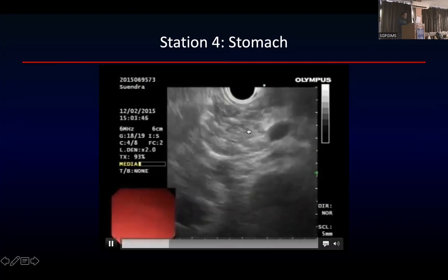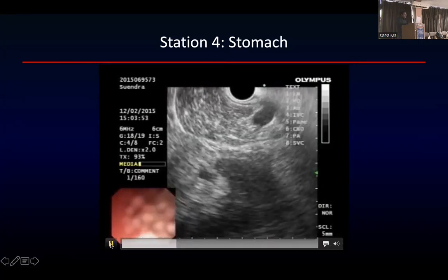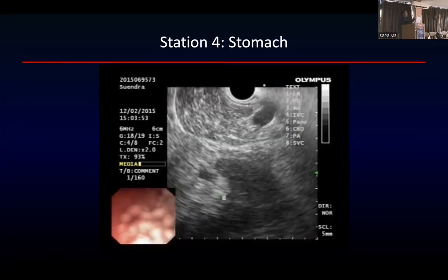Once you see the pancreas, you rotate your scope clockwise with a pull back. What did you do? You saw the aorta, pushed in, the pancreas came, and from the pancreas you are rotating clockwise and pulling the scope. Why? Because now to see the left-sided structures you have to go clockwise, and pull because the spleen is slightly upward. If you do clockwise with pull, you will see the kidney, then the adrenal, then the spleen, and then you will be able to see the splenic hilum.